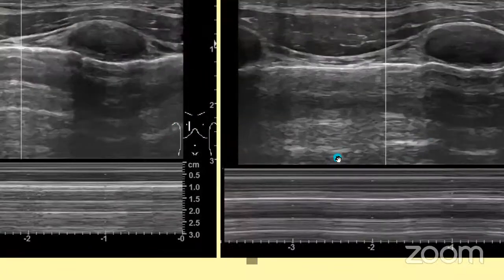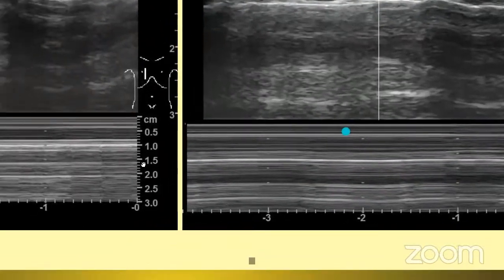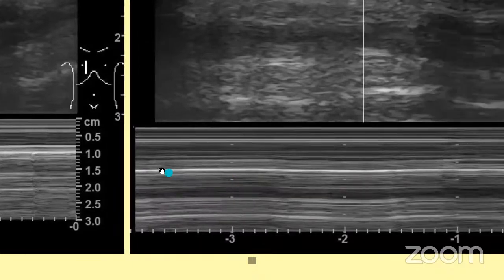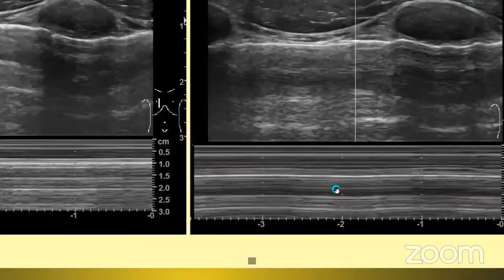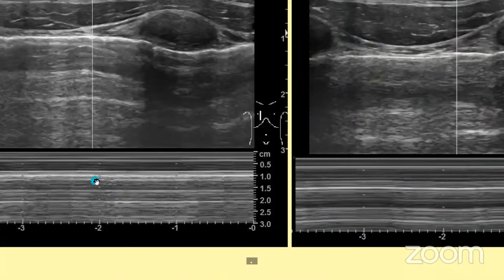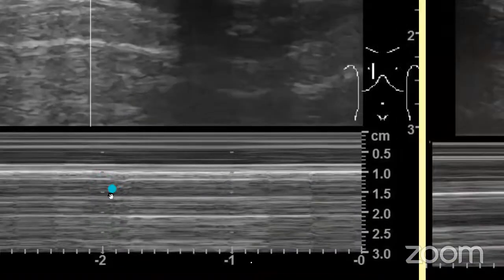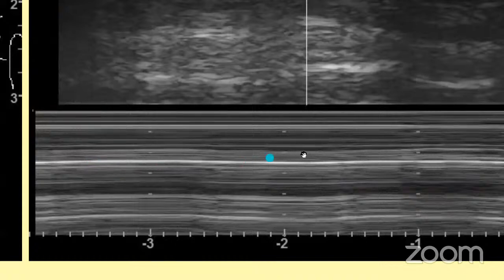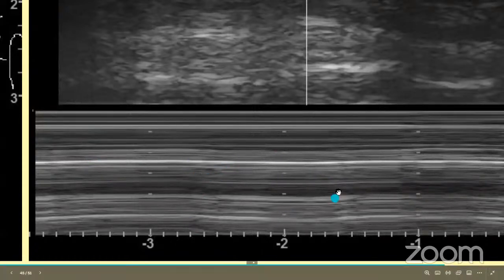However, when it comes to the left lung, I am not able to appreciate the sand-like texture. So this is more jagged. I'm not getting the speckles-like thing, right? This is more straight. I am getting a lot of speckles here because the pleura as well as the tissues under the pleura, which is lung tissue, are moving. However, here I'm getting almost straighter lines. This is because there is little to no movement here.